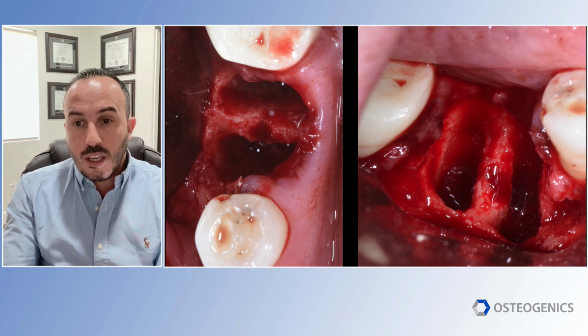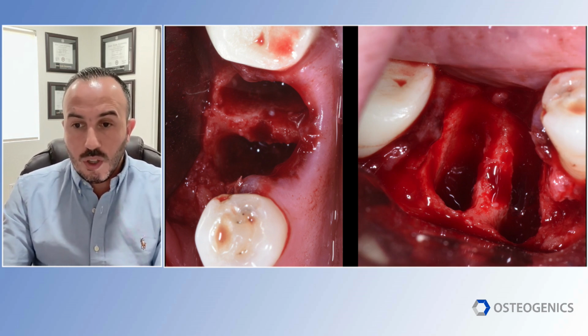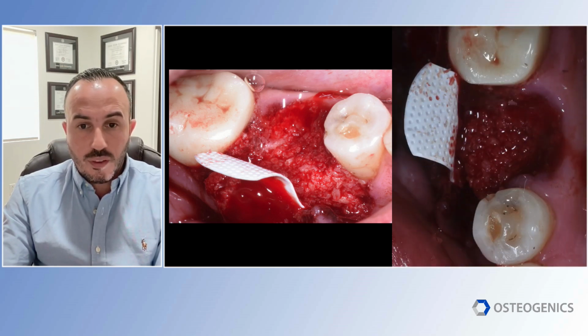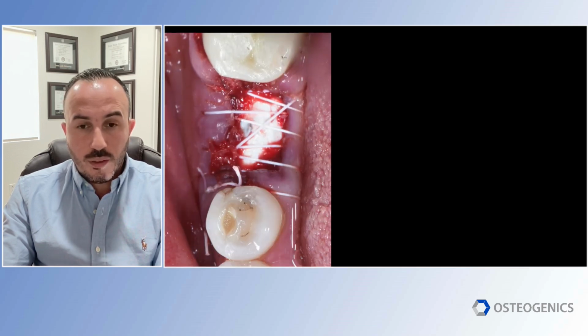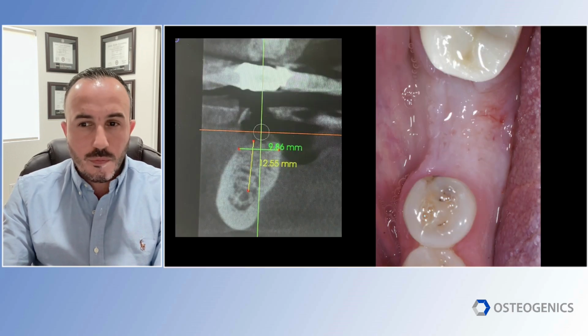So in this case, we were not able to place the implant, and we have a buccal vertical bone loss, a deficiency on the mesial root, more severe than on the distal. We place the titanium reinforced PTFE membrane, and remember this is the dense one, with allograft, and we suture with Cytoplast sutures. You can leave it open healing. No worries, and ask me how I know that there's no problem. I'll show you other cases.